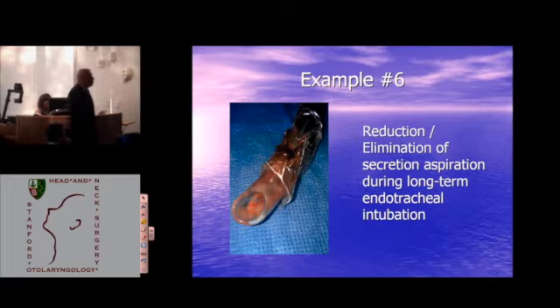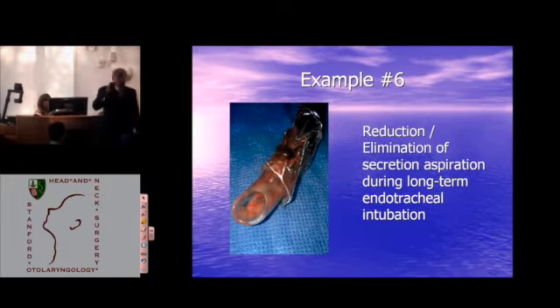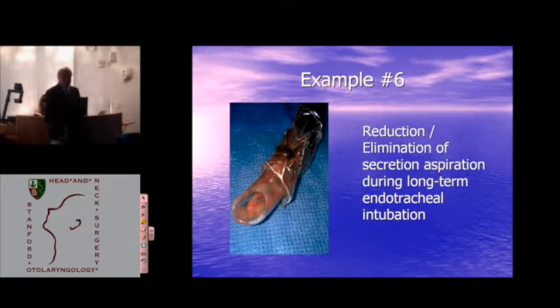It just escapes me. There are some new ways to make things, and some people I've consulted with have said, well, if you're going to have an inner cannula, it's going to have to be really thin, because we don't want to lose ID of the tube. That's so critical to people. But what do you think the ID's like here? Okay. And here is all of this stuff sitting right above the airway, okay? And so why do we have early onset ventilator-associated pneumonia? Well, that's a huge contributor to it.